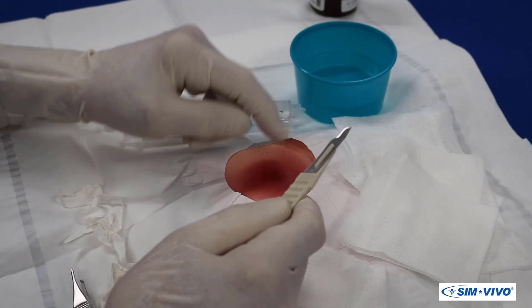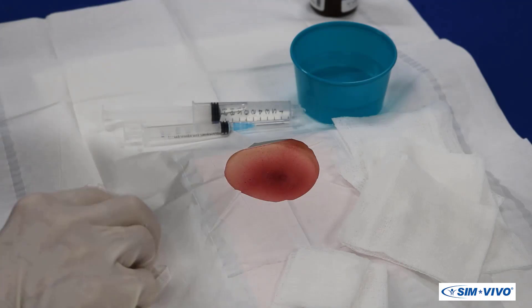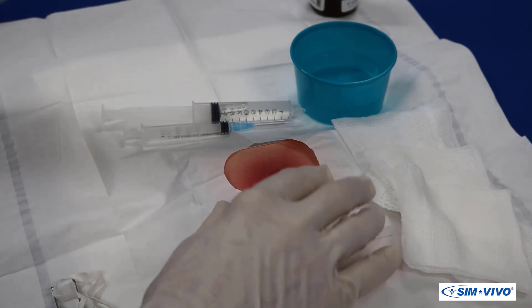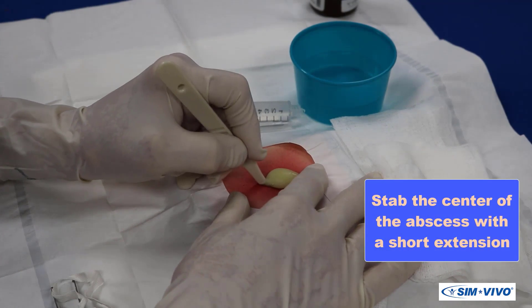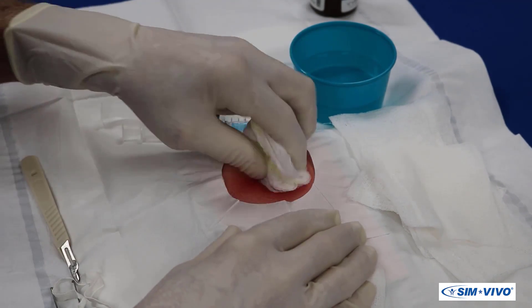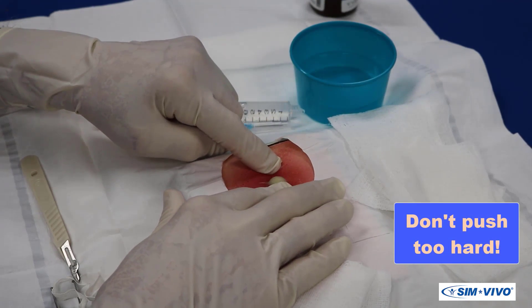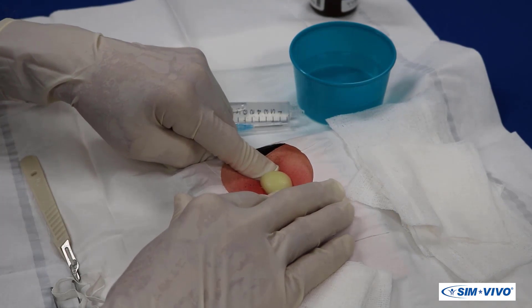Now it is time for the incision. In most cases, the incision will need to be large enough to allow complete drainage and prevent the early sealing of the skin. Hold the scalpel like a pencil and stab the center of the abscess followed by a short extension. Wipe the purulent material away with 4x4 sponges. Gently compress the skin around the opening to evacuate more pus and wipe it away.